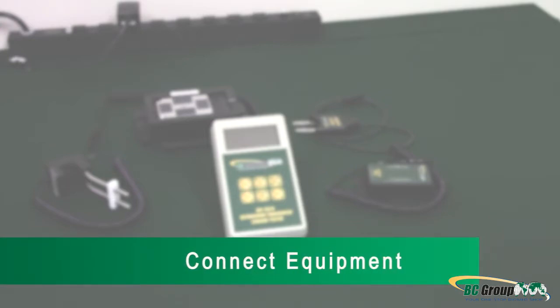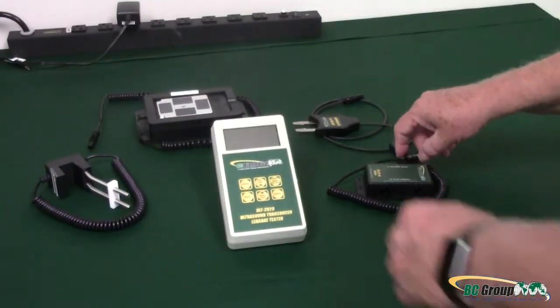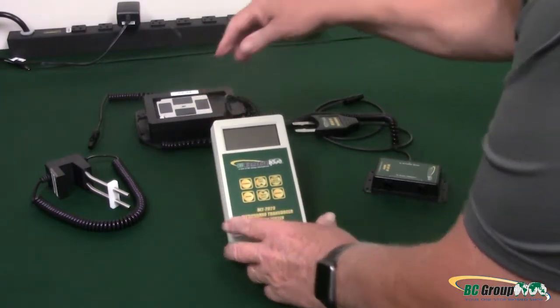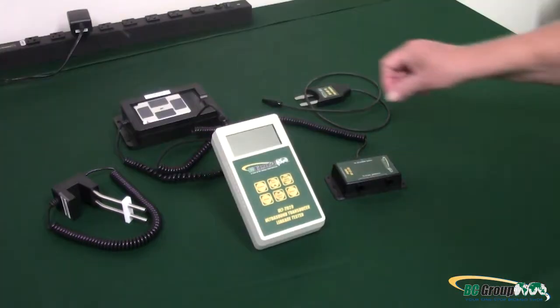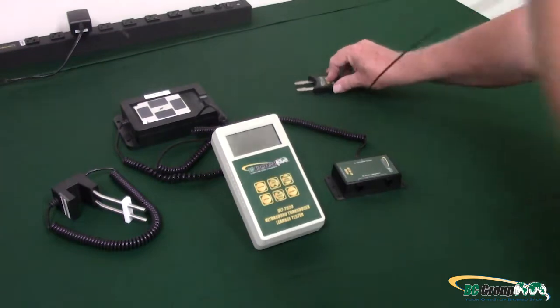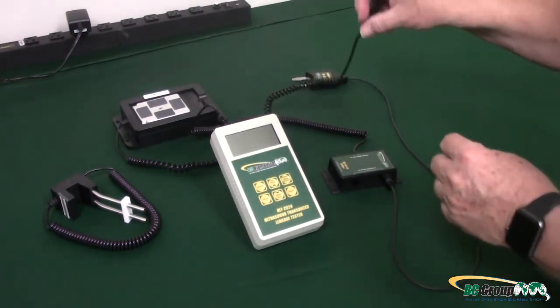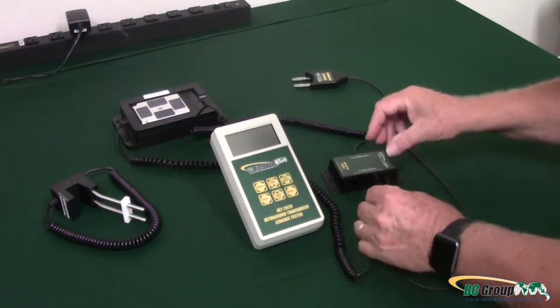Step 2: Connect Equipment. To start, plug the splitter into one of the two ports on the top of your Ultrasound Leakage Tester — you can use either port. Plug your Fork Adapter into one of the ports on the splitter. Then plug your Ultrasound Leakage Adapter into the other port on the splitter.